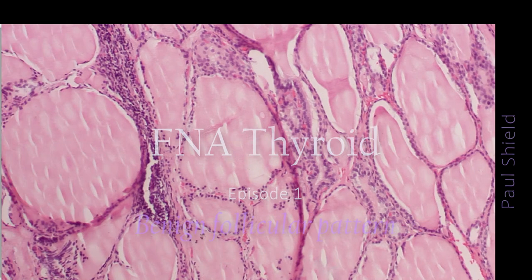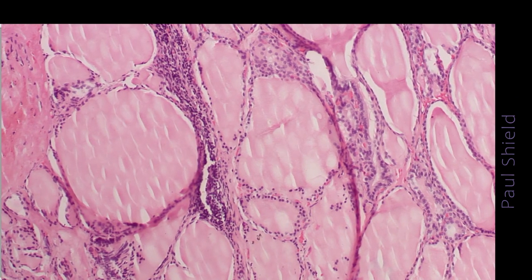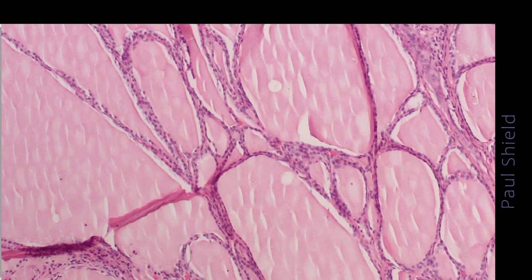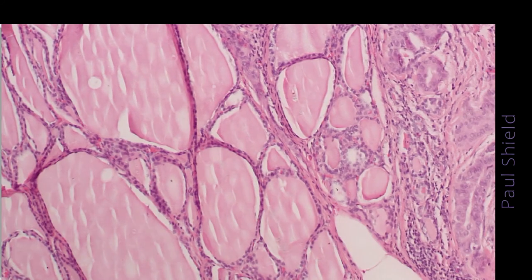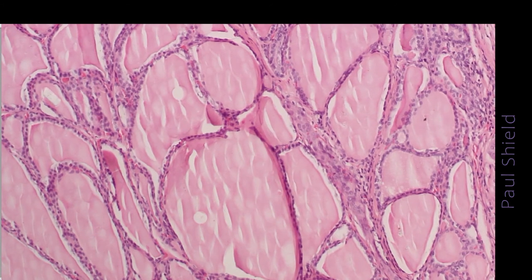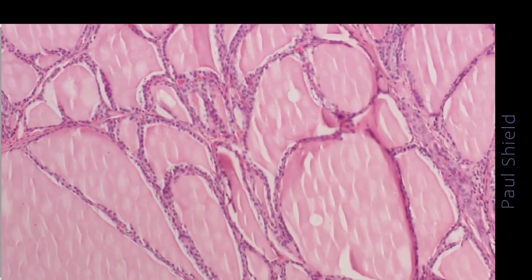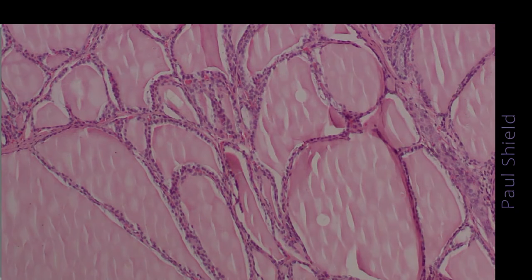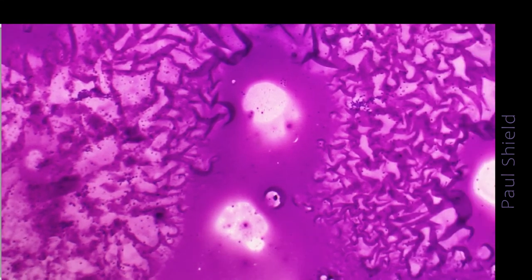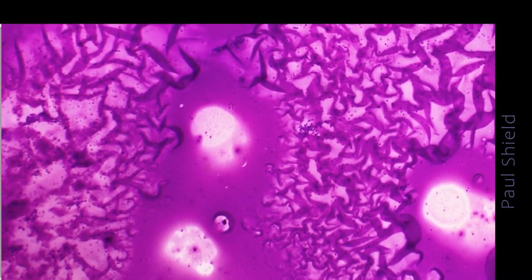Just a reminder of what histology of benign thyroid looks like. It's made up of all these different follicles of varying size, so some quite small ones to quite large ones, lined by follicular cells, and inside them is colloid. That's this pink material. When we sample them, we sample a lot of colloid usually, as well as follicular cells. The colloid in this case is really quite thick and wrinkly.